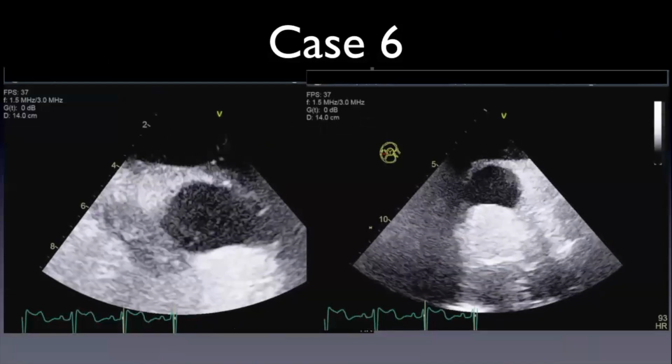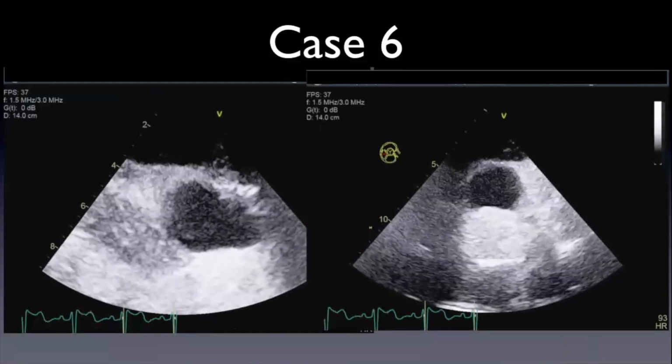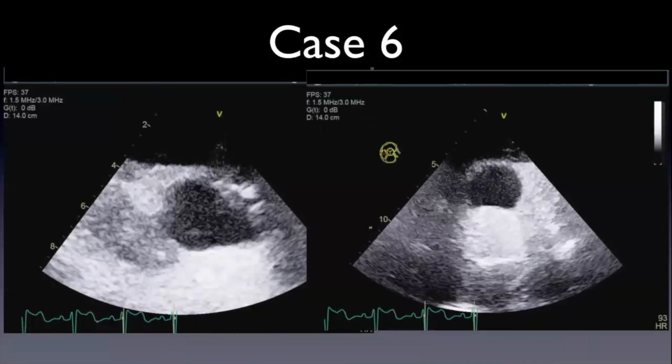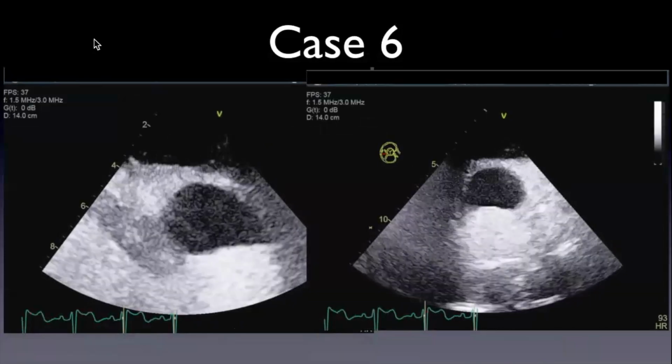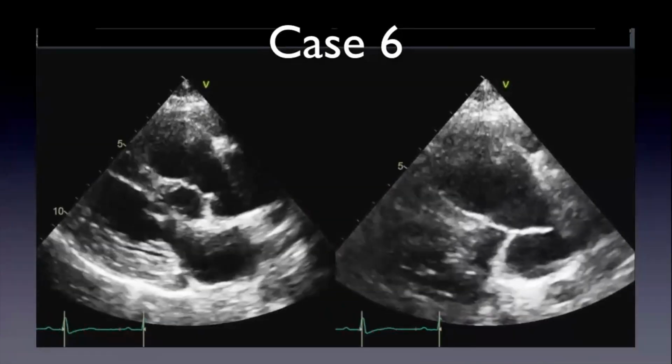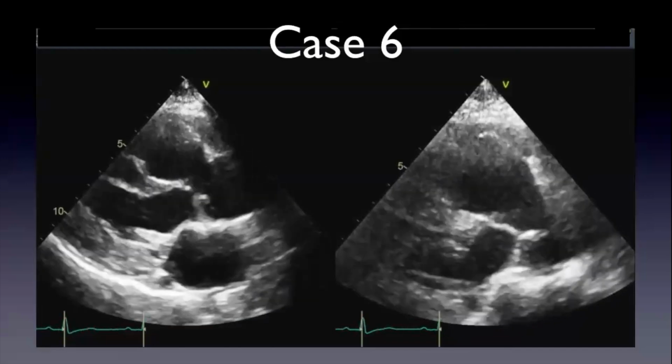What did this surgeon do? Could have left this. Call CPSO. All right, it'll all come clear in a second. Don't call CPSO. This is pre-op.